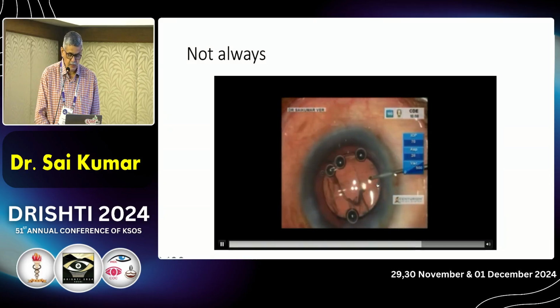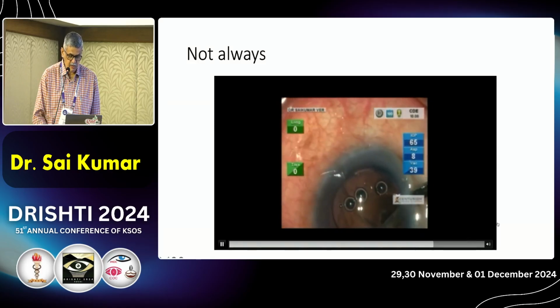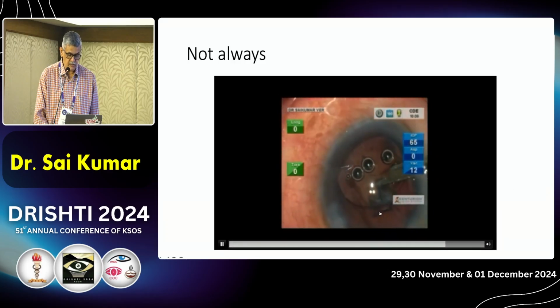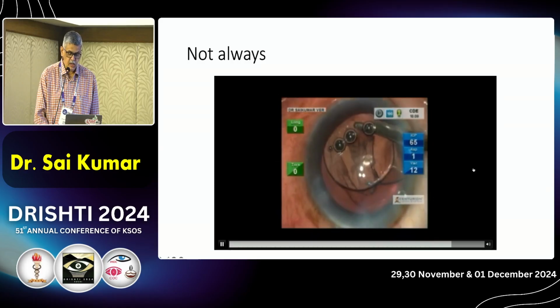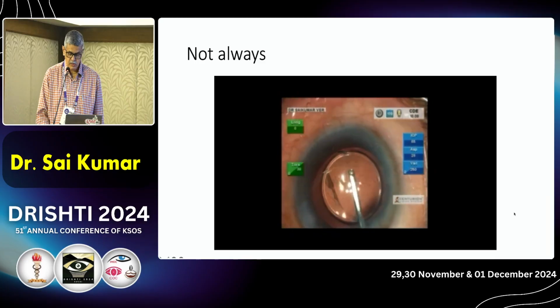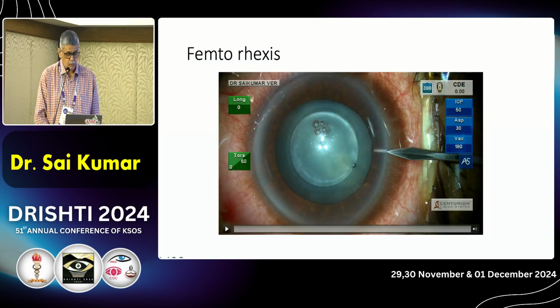So here, before you come out, always fill the chamber with a dispersive viscoelastic, and then again here a 3-piece lens goes in and is captured. There is no vitreous there. I have not done an anterior vitrectomy. There was a small piece of cortex remaining there. I went in with a Simcoe cannula with a very low irrigation and removed that piece of cortex once the intraocular lens was implanted. So maintaining chamber is extremely important in all posterior polar cataracts.